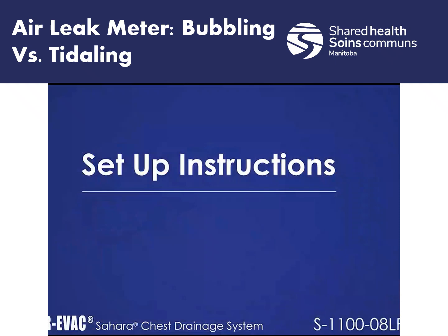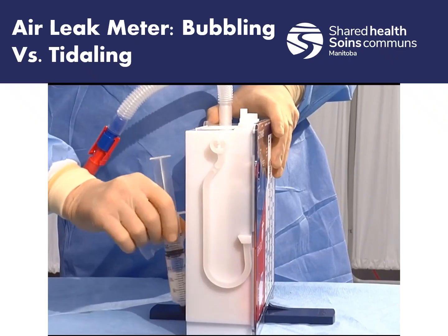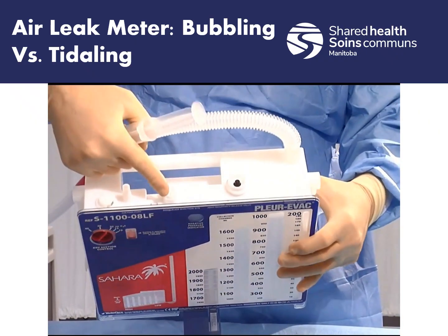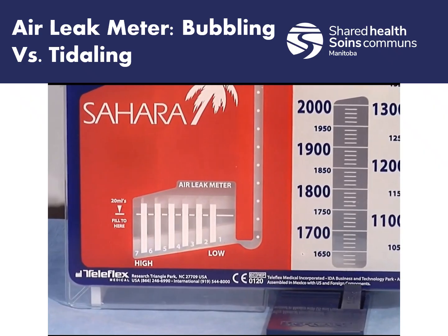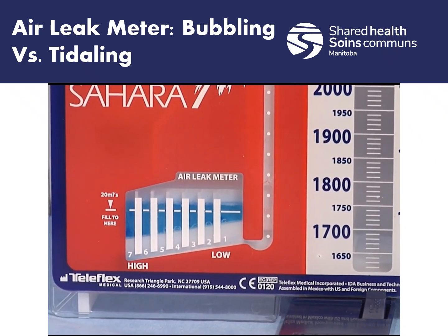So with that, to set up the air leak meter, the PleuraVac device comes with a sterile pre-filled syringe attached to the back of the PleuraVac device. So what we're going to do is take it off from the back of the device. We're going to take the cap off, and like I mentioned before, there's an insertion site on the top of the device itself, and we're just going to attach it in there. We're going to push the syringe down and fill it up. When we put the fluid in, it will turn blue, and that's totally normal. And that's how we want to set it up. Technically, if you are picking up this patient for a transfer, this should have been done for you already.